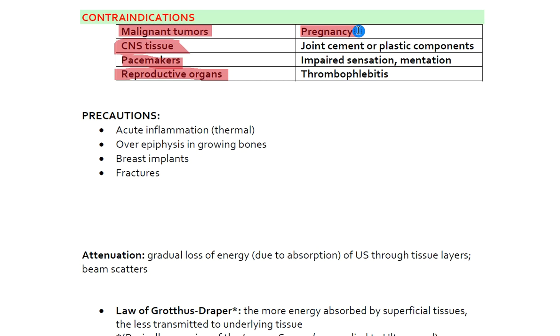So if a pregnant woman had a right hip trochanteric bursitis and we want to do ultrasound to that area, that's certainly well over 5 centimeters from the area. So that would be okay, but you could see there might be some concerns with doing ultrasound to the lumbar spine or the hip flexors or other regions, depending on where you're moving the transducer.